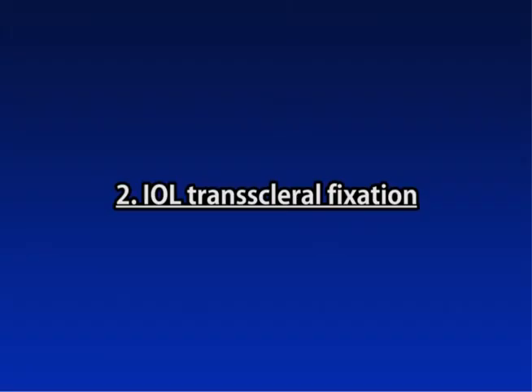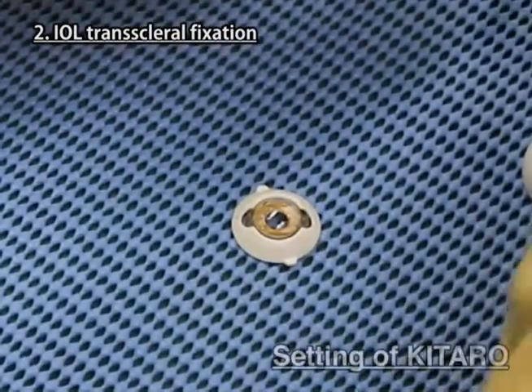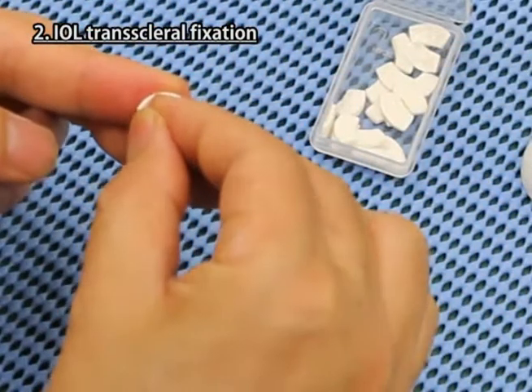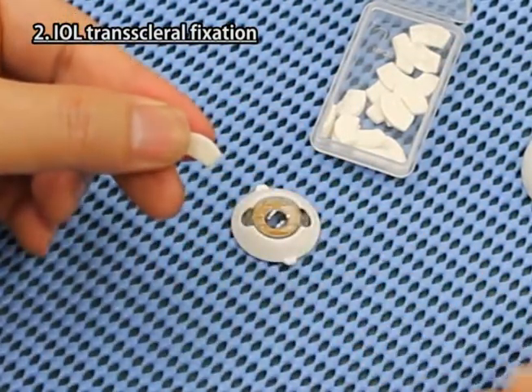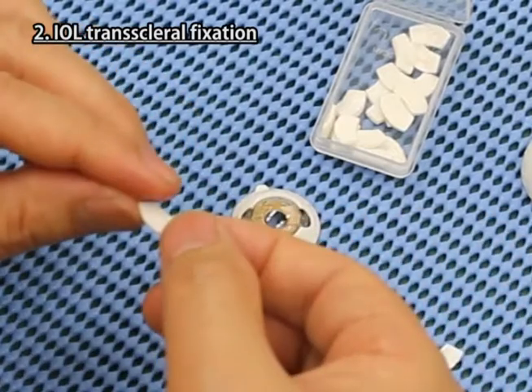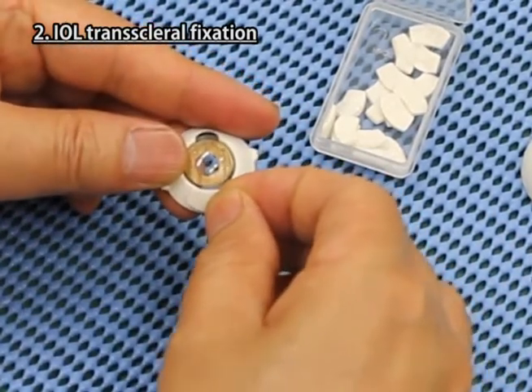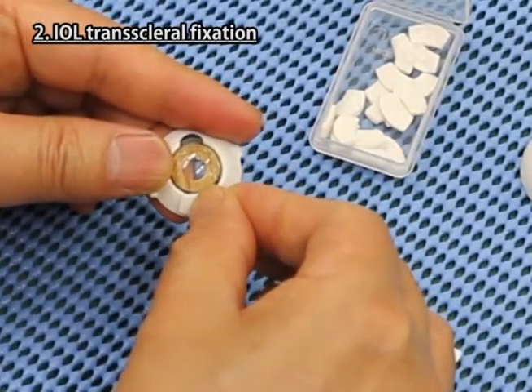IOL Transcleral Fixation. Settings of Kitaro. Take the scleral sheet, detach the paper on it, and attach it tightly to the U-shaped slit of the cornea iris part for IOL Transcleral Fixation, and do the same on the other slit.